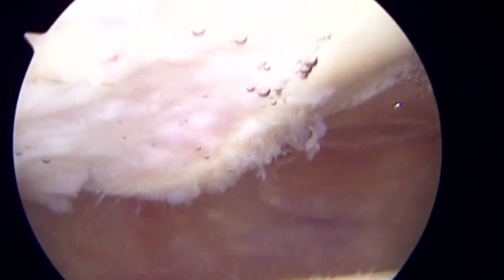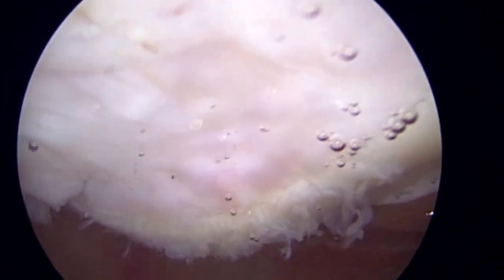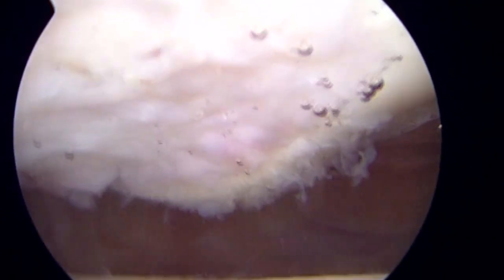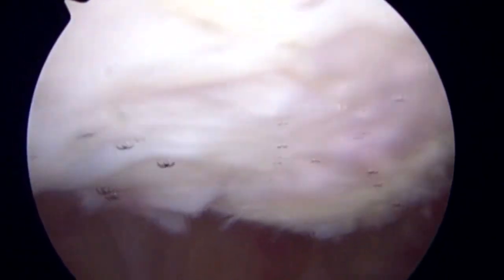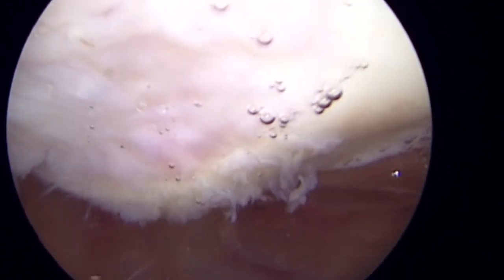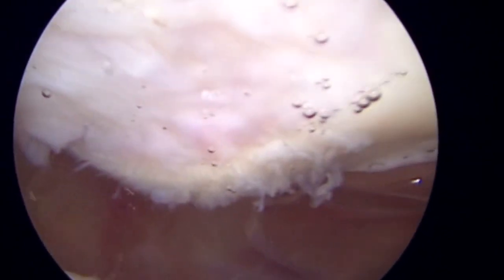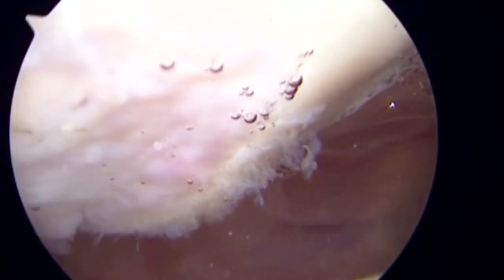Here we demonstrate an arthroscopic second look at graft healing following the aforementioned technique. The patient in question went back to the OR for removal of symptomatic tibial tubercle osteotomy screws, five months following index surgery, and consented to a diagnostic arthroscopy to assess cartilage status. Clinically, she is happy with her result and describes marked improvement of her preoperative retropatellar pain.